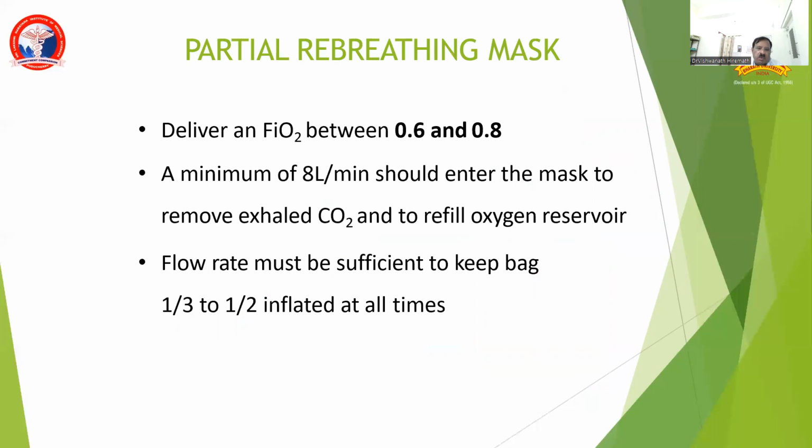5 to 8 liters per minute, or a minimum of 8 liters per minute should enter the mask to remove the exhaled carbon dioxide and to refill the oxygen reservoir. Flow rate should be sufficient to keep the bag 1/3 to half inflated at all times. It should not collapse.